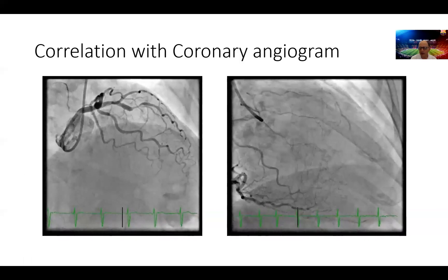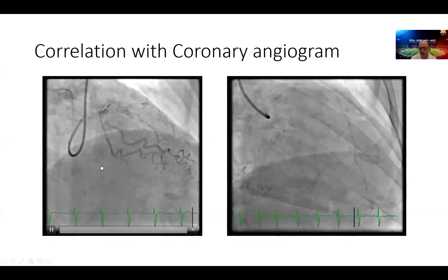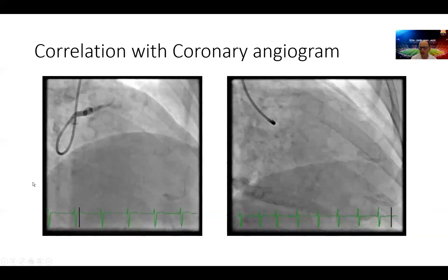Myocardial blood flow showing impaired blood flow reserve beyond the LAD territory, left ventricular dilatation with stress, increased RV uptake with stress, drop in ejection fraction with stress, all markers of high risk.